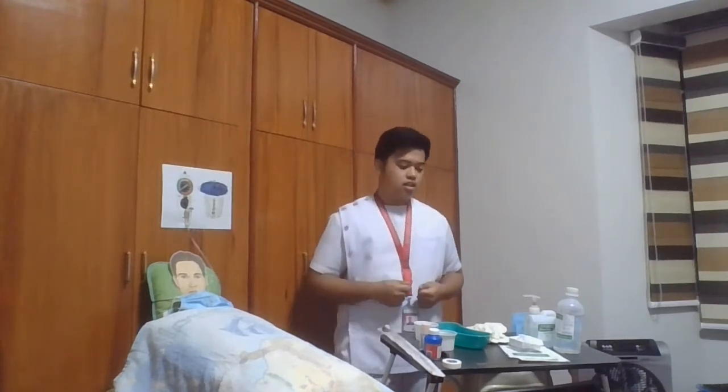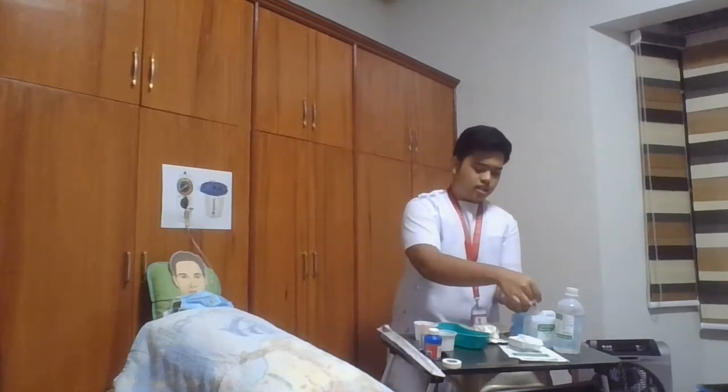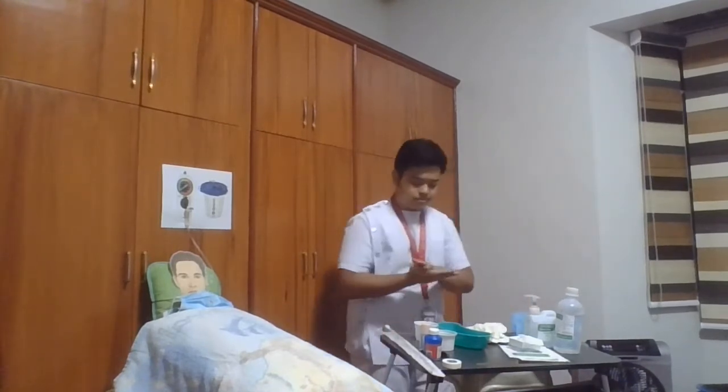After getting our patient's consent, we will now begin by performing hand hygiene. In this case, I will be using an alcohol-based hand rub. And then after that, we're going to adjust the bed to a comfortable working position.